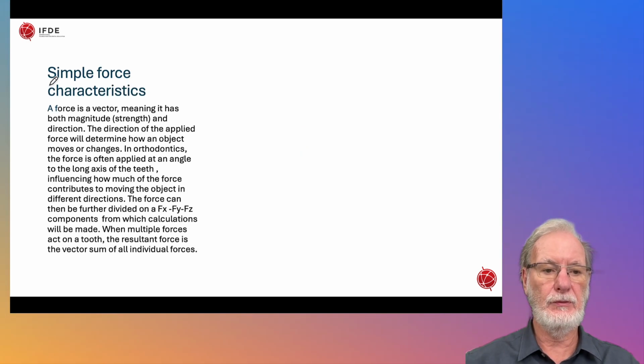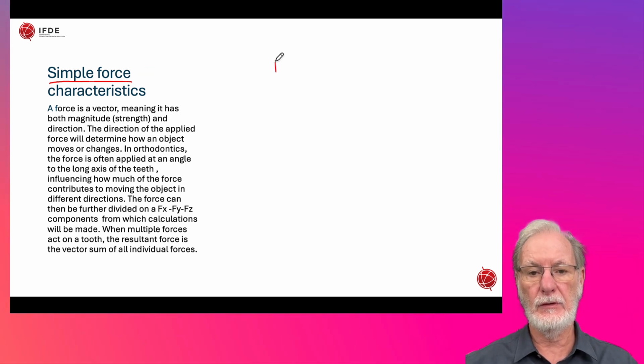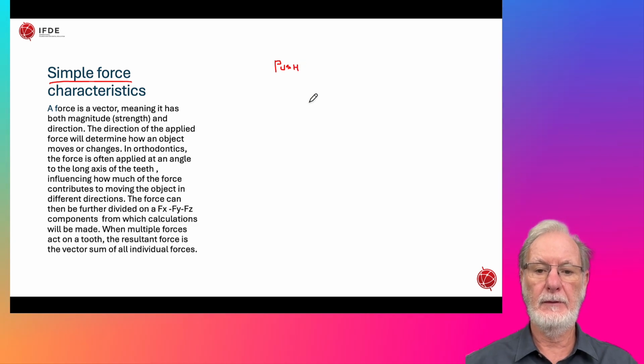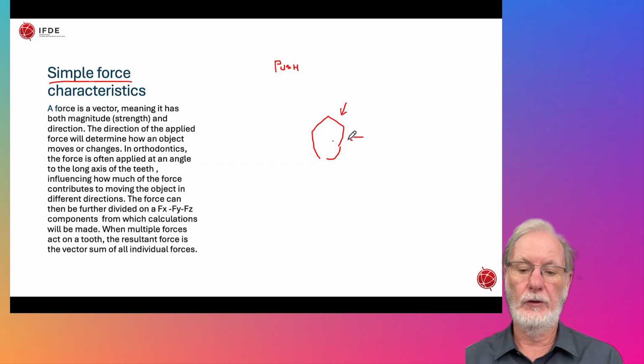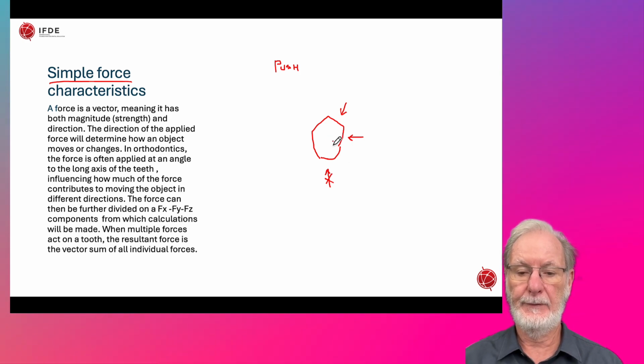In orthodontics, we use simple forces a lot. In aligner movements, those forces only translate to a push, meaning that when you have a tooth, you can push on it in all sorts of directions, for intrusion, for crown movement, but you cannot really pull it up if you do not have specific attachments.